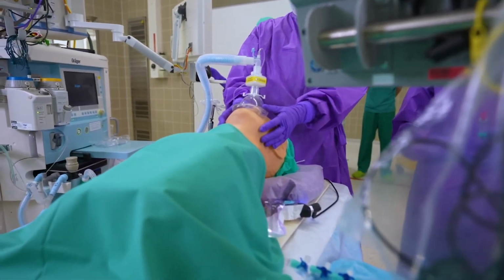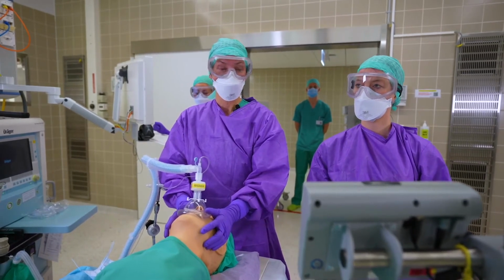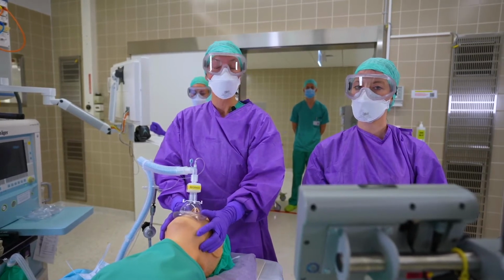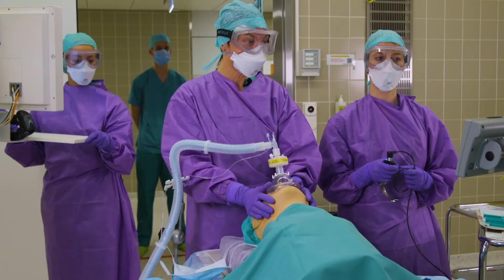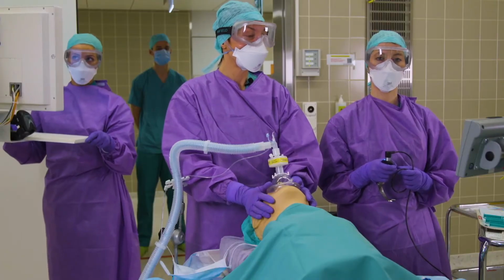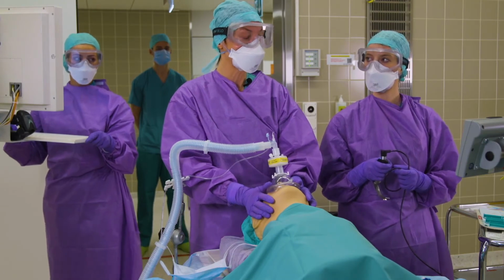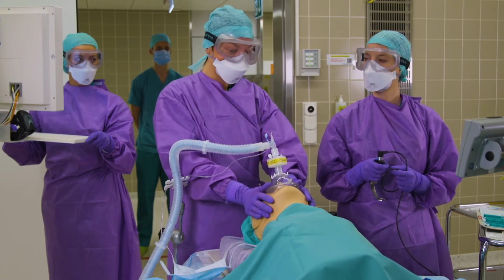After a thorough pre-oxygenation, we are starting our rapid sequence induction. RSI is used to avoid backmasking the patient for prevention of aerosolization. Here, avoiding coughing with a thorough relaxation is also of utmost importance. We induce the patient and our patient is paralyzed.